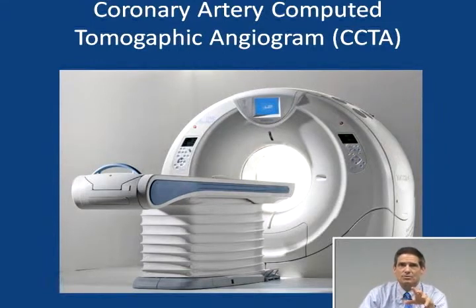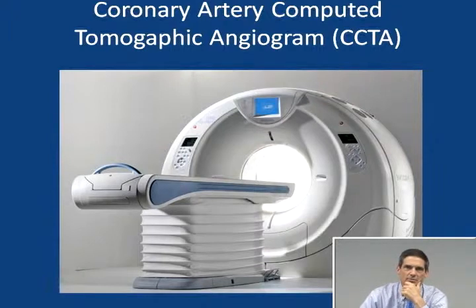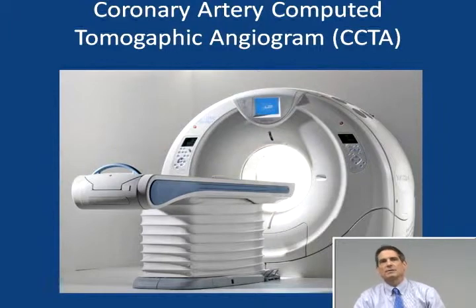If the calcium score is not 0, and you want to look at the coronary arteries but you don't want to go to the cath lab, this is your study. But the ordering and interpreting control of this modality is very controversial, mainly because of the turf war it provokes between cardiologists, who have usually done all the cardiac imaging, echoes, cardiac caths, myocardial perfusion studies, and the radiologists, who usually read everything that comes off the CT scanner. So this particular study has provoked this turf war.